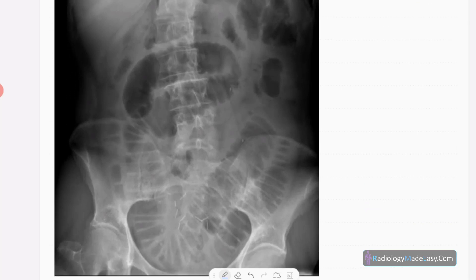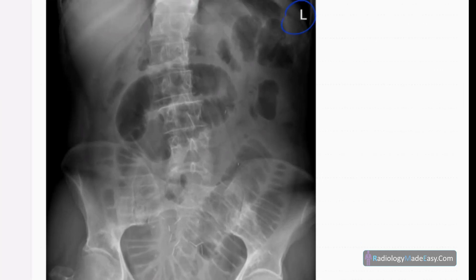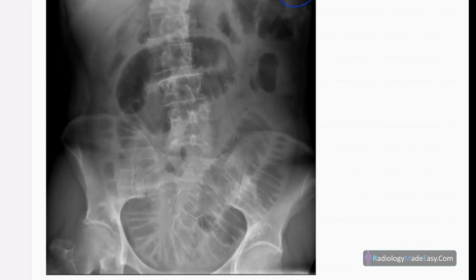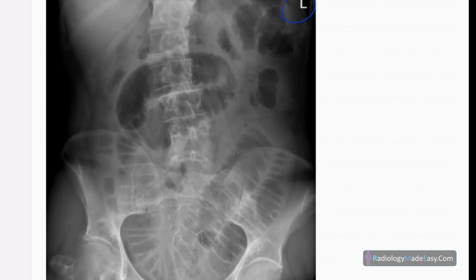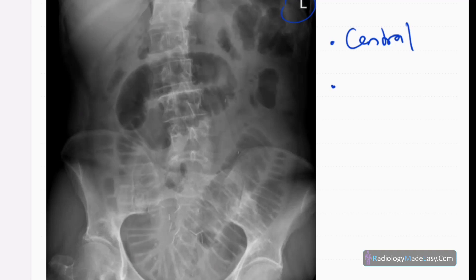This is the anteroposterior radiograph of the abdomen in a skeletally mature patient — a supine X-ray. This is the left side. You can see a few abnormalities: there are multiple dilated bowel loops, centrally placed, and they have valvulae conniventes — you can see the complete rings.